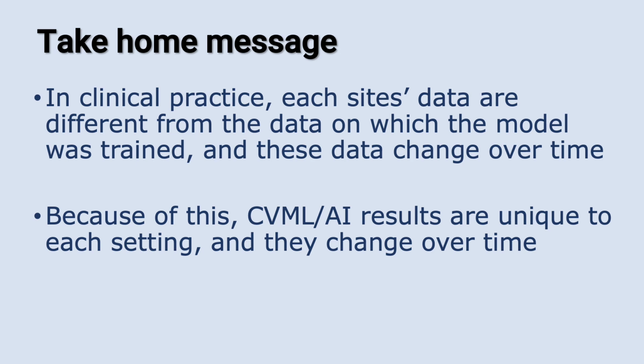So the take-home message today is that in clinical practice, each site's data are different from the data in other places, and it's certainly different from the data on which the model was trained, and all of these data change over time. Because of this, computer vision, machine learning, or AI results are unique to each setting. They change over time. They may be only a little bit different in your place than somebody else's, or they might be a lot. You don't know. And you definitely need to monitor how things are changing over time, because you don't know whether it's going to change a little bit or a lot.